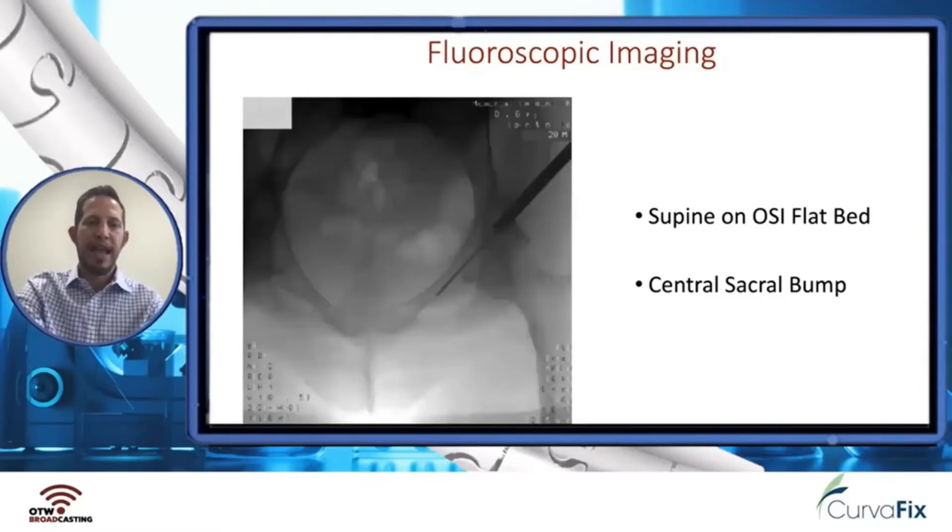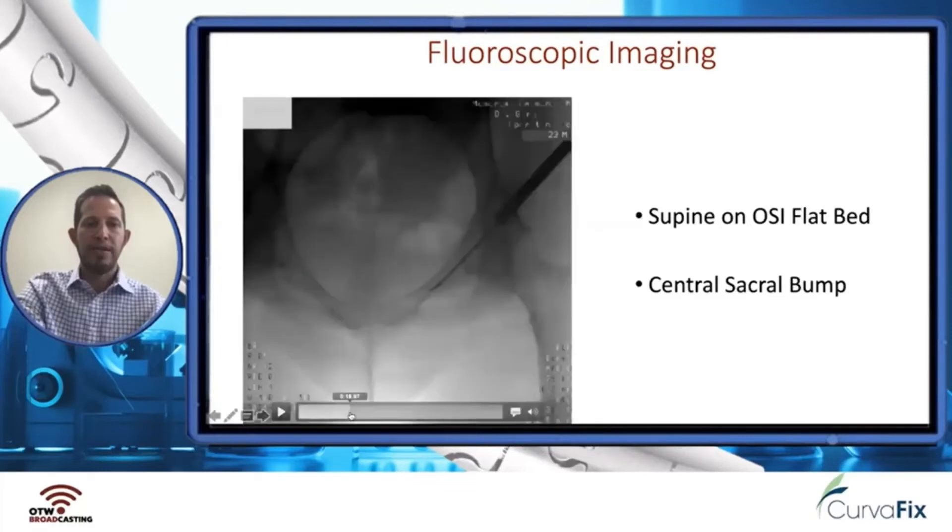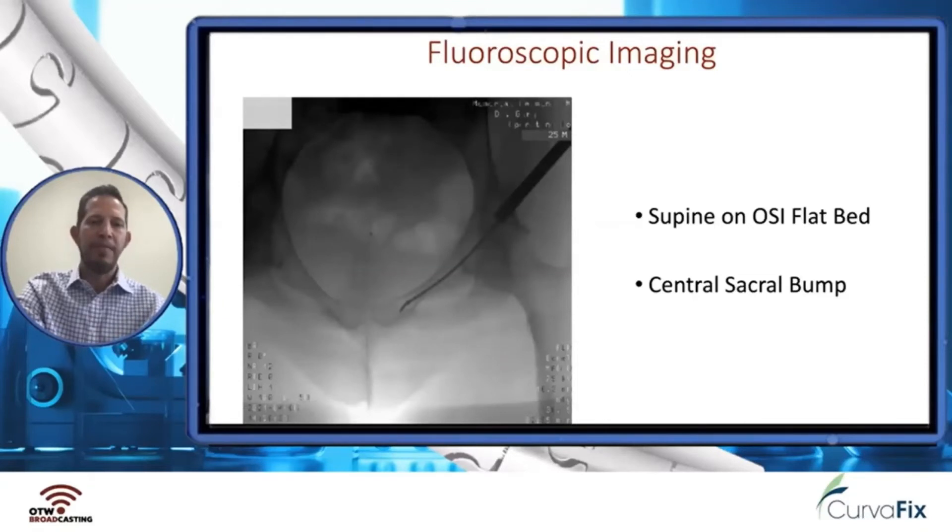Here you can see the wire heading anterior and would exit out the anterior ring, so we proceed on. You can see us using the turn of the bend in the guide wire to accommodate the canal and enter the metaphyseal bone of this medial superior ramus, which can be very difficult to achieve. You can see the bend in that wire on the inlet image and how anterior you would need to start.